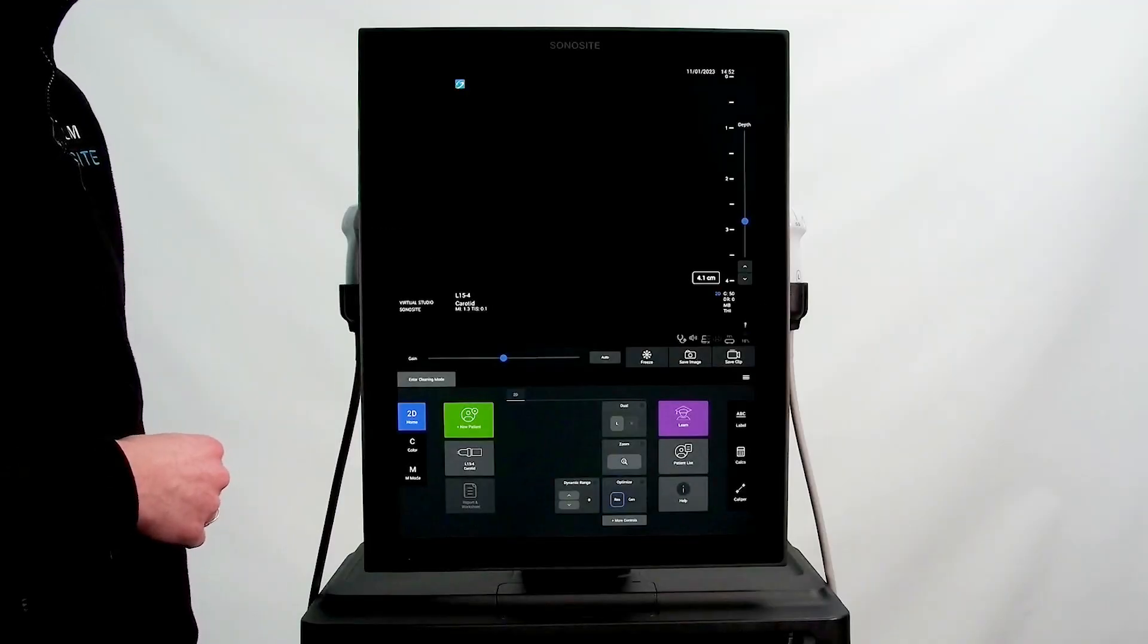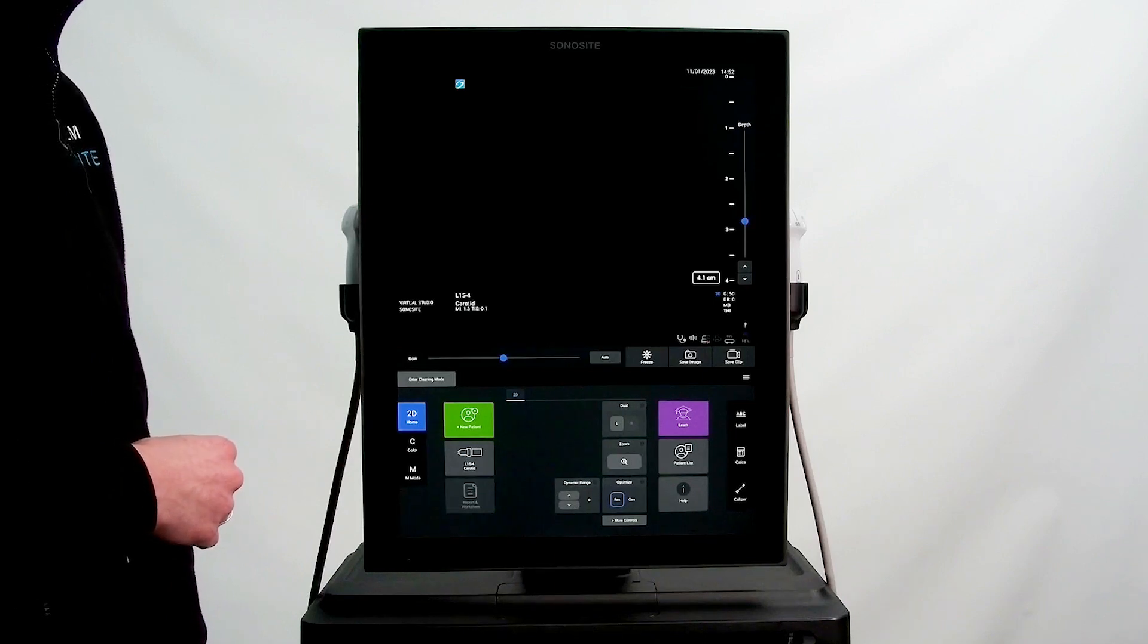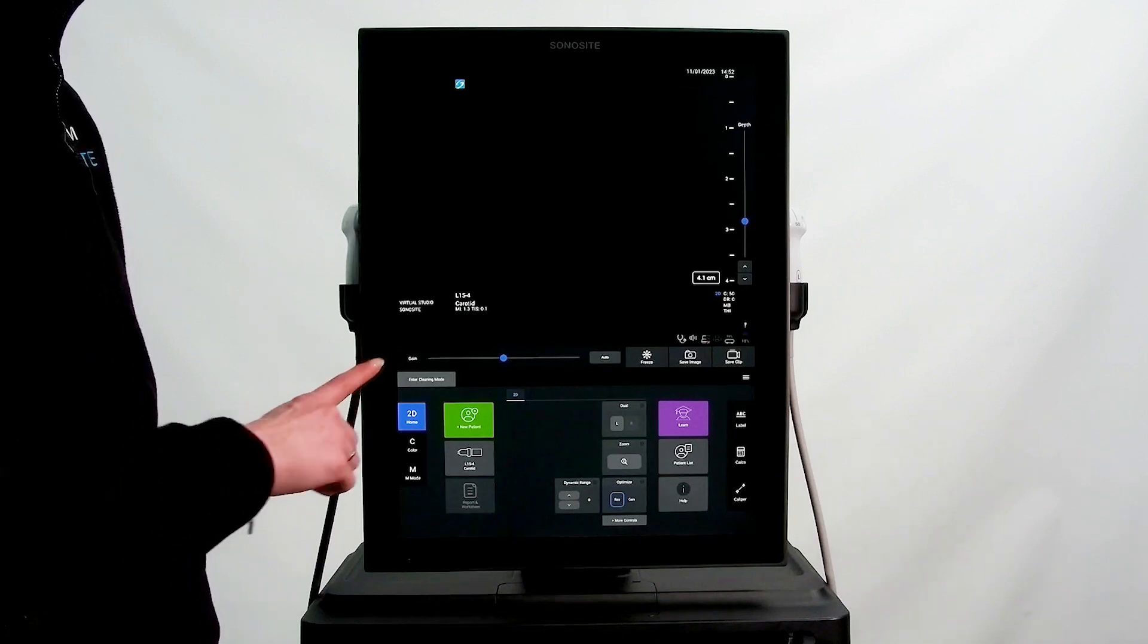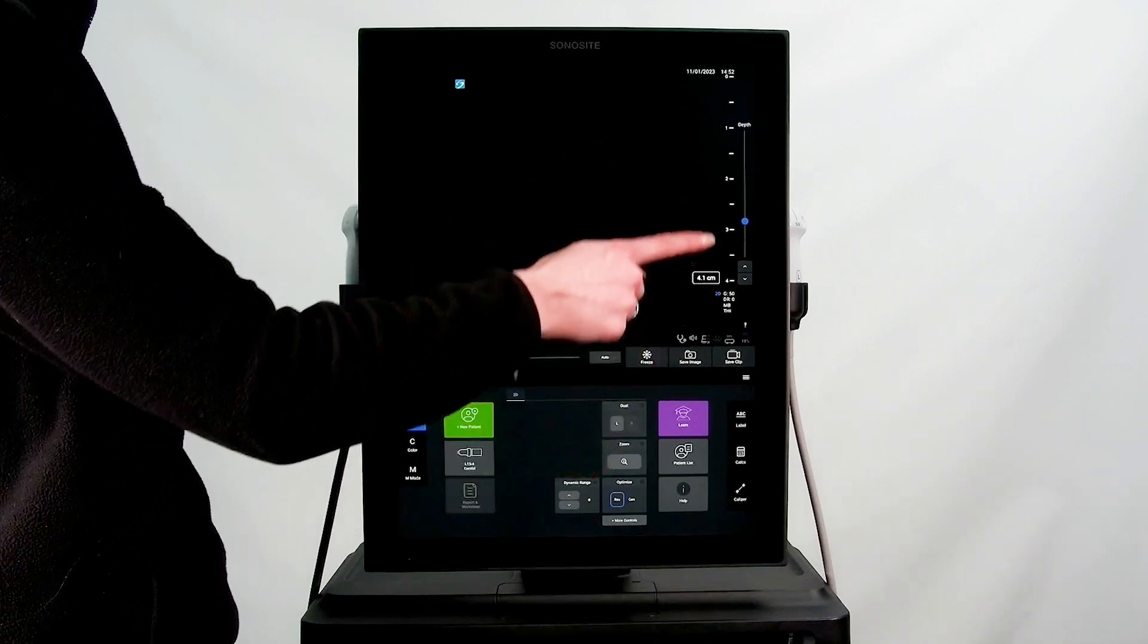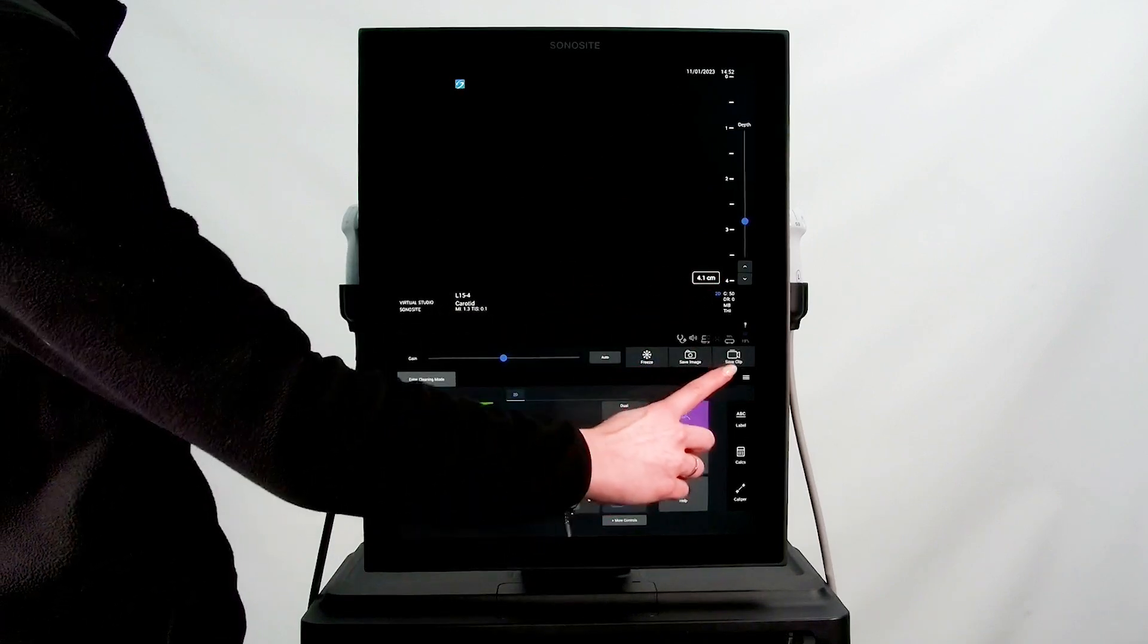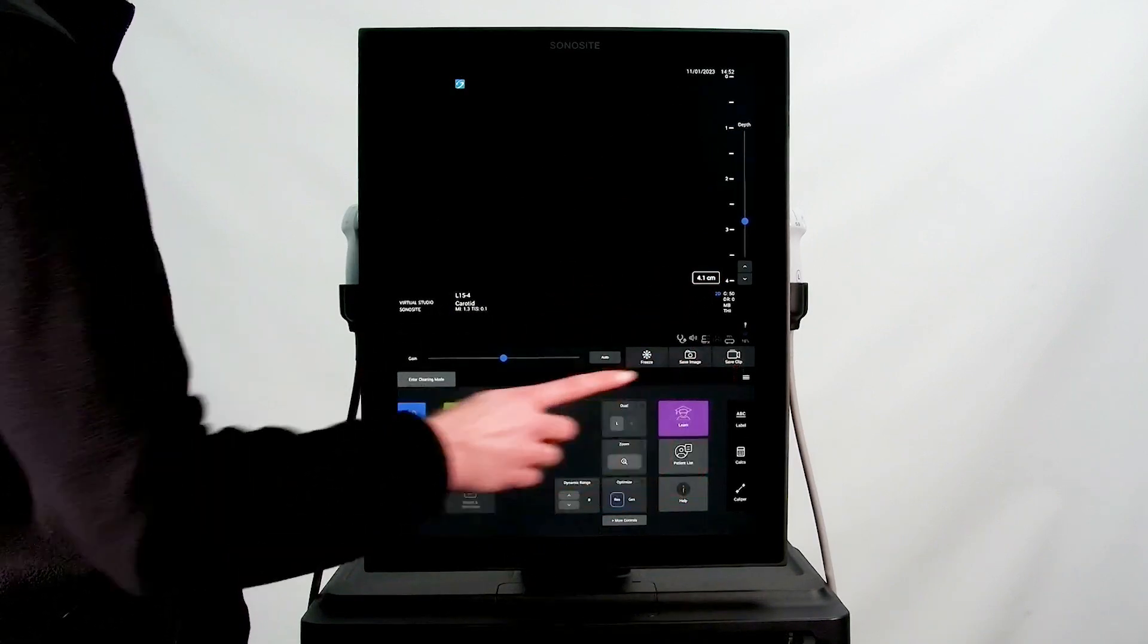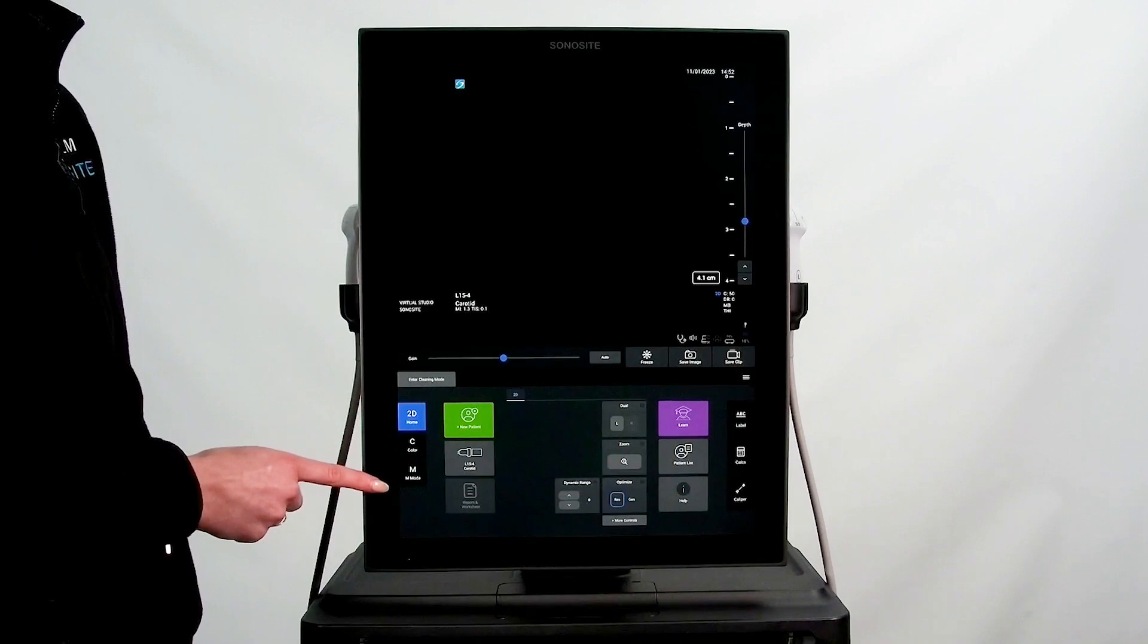The interface for Sonocyte ST is controlled entirely on its large touchscreen. The controls for gain and depth, freezing and saving images and clips, and imaging mode controls are all right at your fingertips.